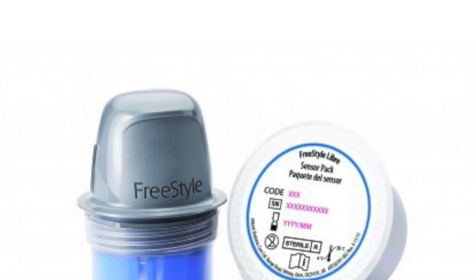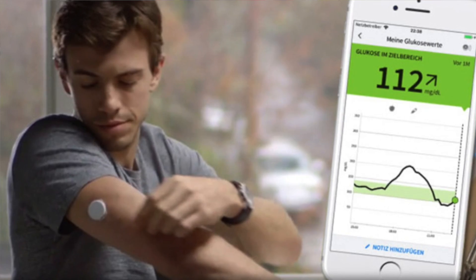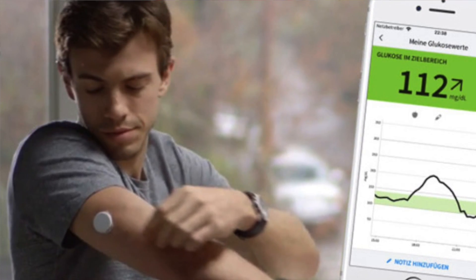The Freestyle Libre system comes with a reader, a sensor, and an application device. The sensor is the thing you actually wear on your body. It has a microfilament that will sample your interstitial fluid and continuously sample blood glucose throughout the day, giving you more information about how your blood glucose is throughout the day. You don't have to just do these spot tests where you prick your finger with the lancet, squeeze the blood out, and get a blood sugar reading.